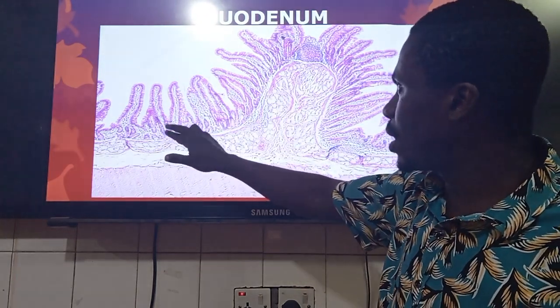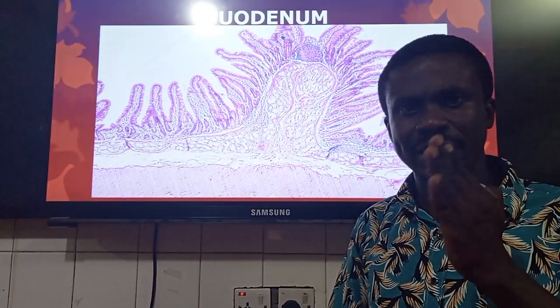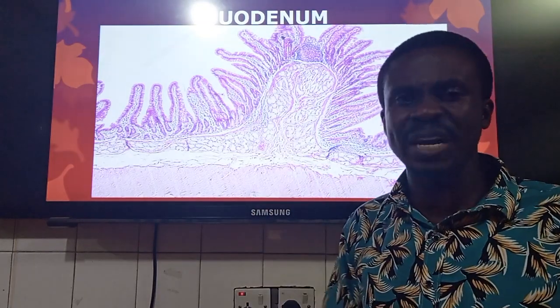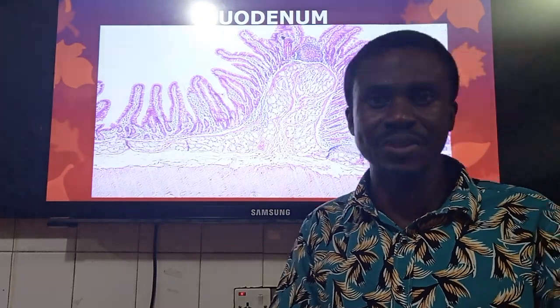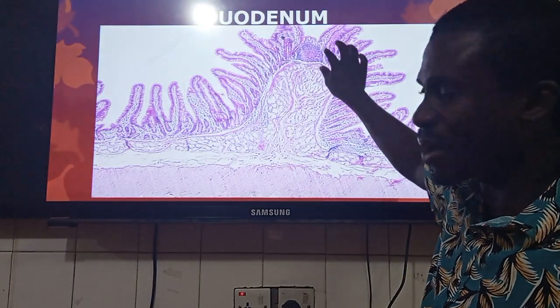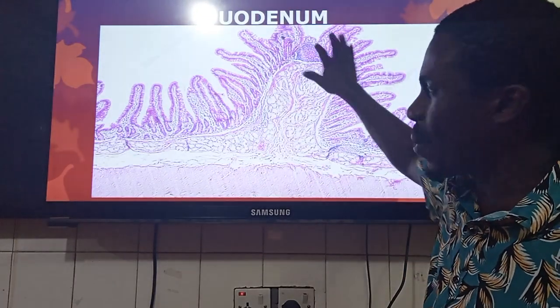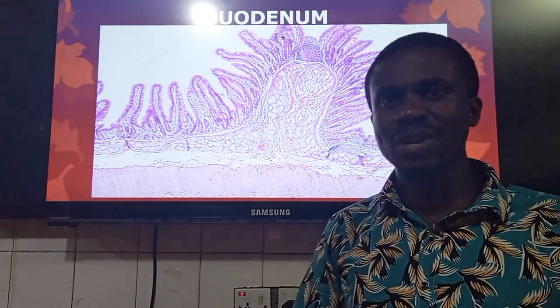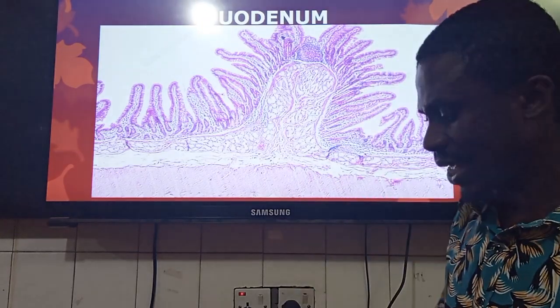One more thing I want you to know is related to the distal portion of the duodenum, which becomes very prominent in the jejunum, and ends at the proximal portion of the ileum. We see this fold, which is formed by the epithelial lining and lamina propria, that's the mucosa, with a core formed by the submucosa. This is what we call the plicae circulares. The plicae circulares are relevant as far as absorption is concerned, very prominent in the case of the jejunum.